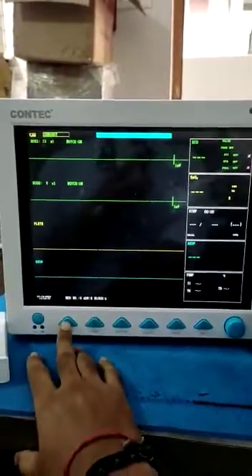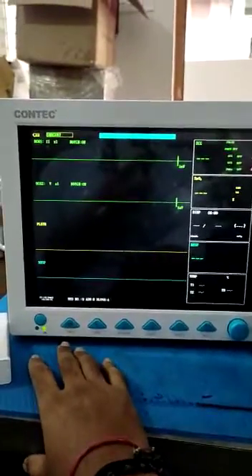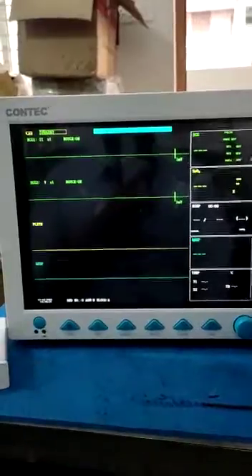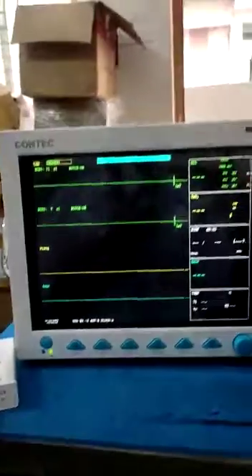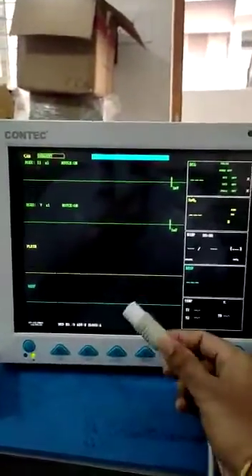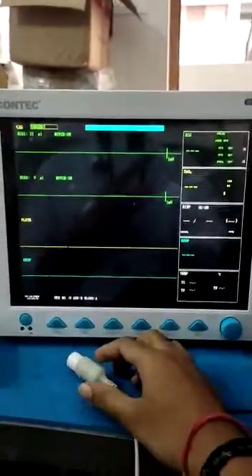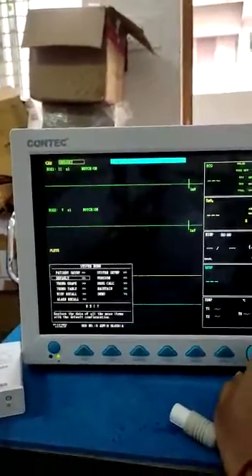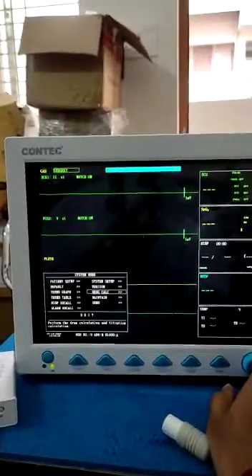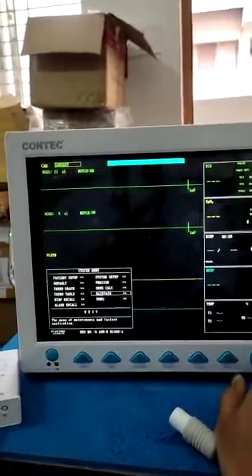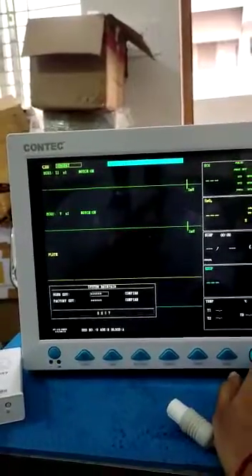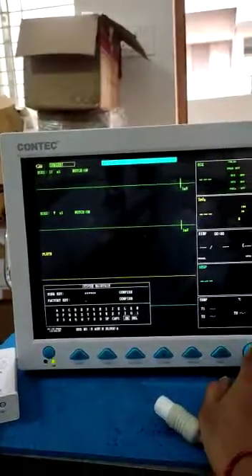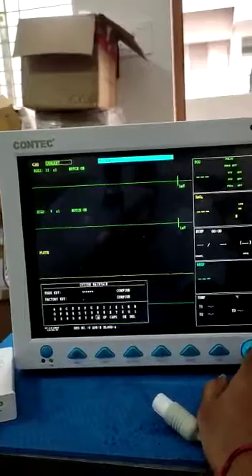This is our CMS 8000 monitor. I will show you how to connect the EtCO2 module. Go to the Menu, then go to Maintenance. This is a five-parameter device, and for seven parameters we have to activate the EtCO2 module.